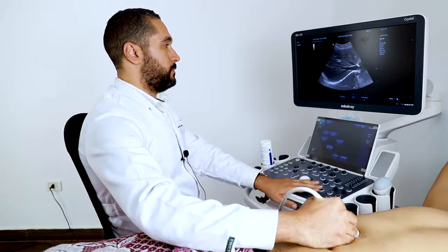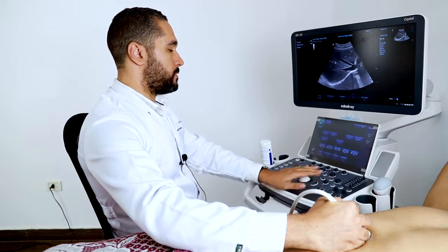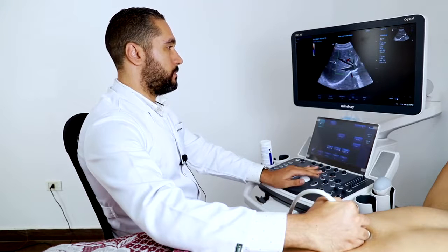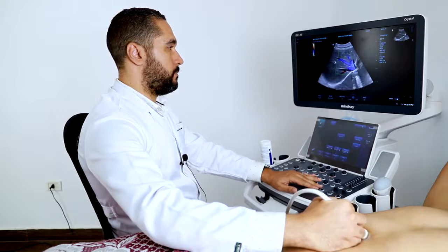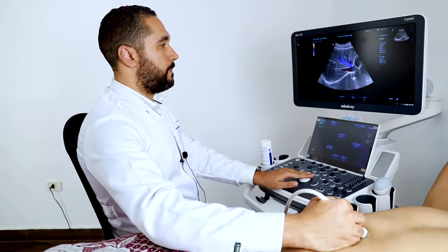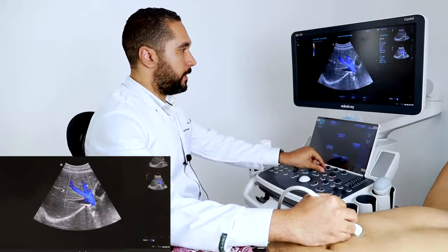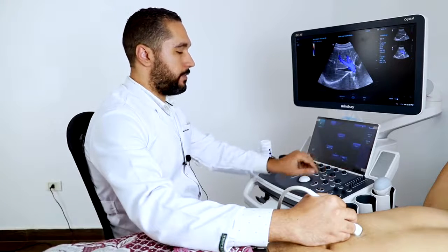I'm going to show you the color Doppler of the hepatic veins. We have a great filling of the color Doppler in the hepatic veins.